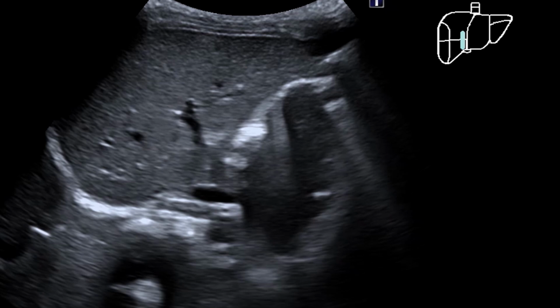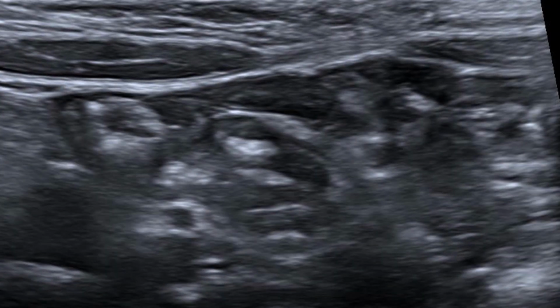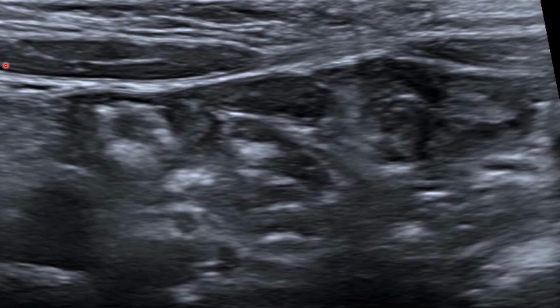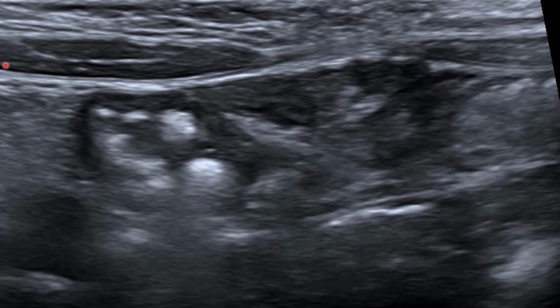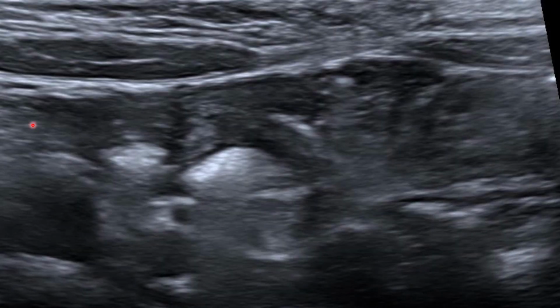So in this presentation, I want to show you something. Most of you have been doing abdominal scans for quite some time, but I want you to appreciate one thing. Some of the machines that you're using, we don't really see the movement of bowel. So I want to show you how bowel movement looks like on ultrasound.